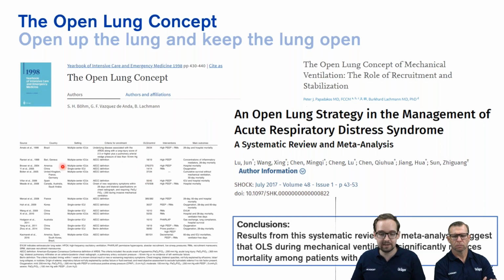You see here different studies from 1998 to 2016. Another meta-analysis, also from 2017, had the conclusion that the open lung strategy during mechanical ventilation could reduce mortality among patients with ARDS. So opening the lung, keeping the lung open.